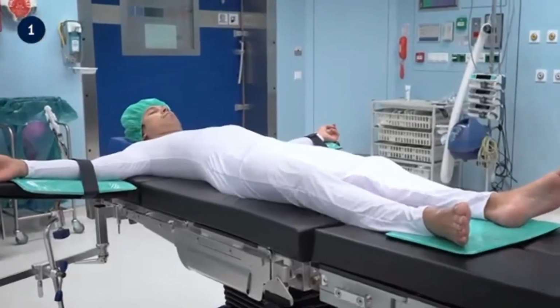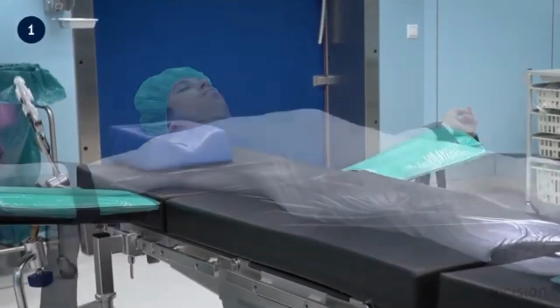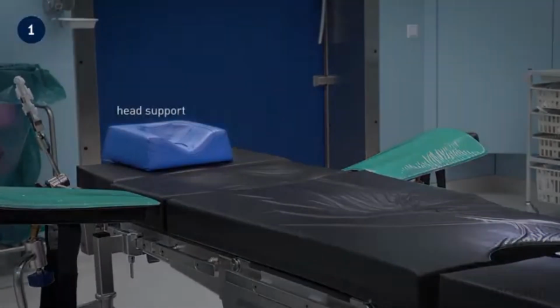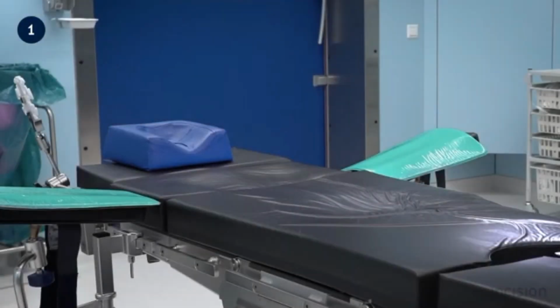Several types of accessories exist to aid patient positioning. A few examples will now be mentioned. As the name implies, the head support is used to support the patient's head and prevent pressure complications from developing in dependent areas, such as the skin over the occiput.